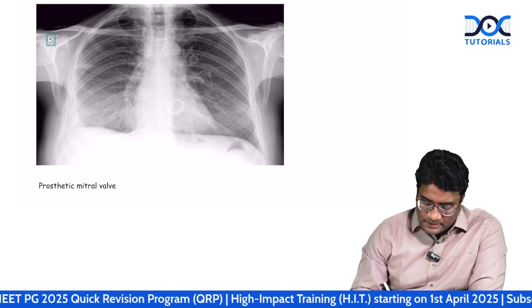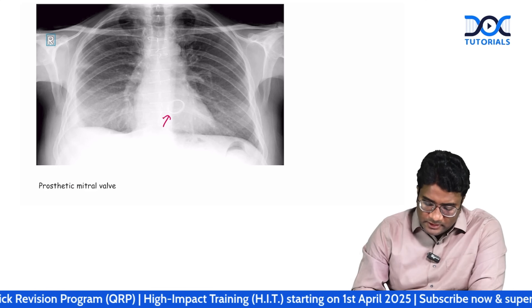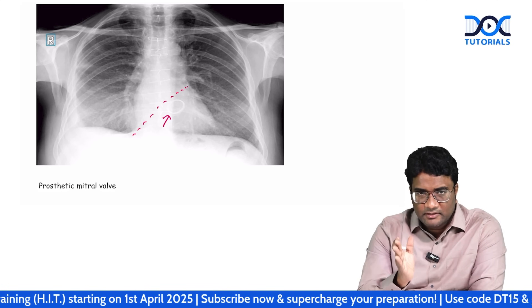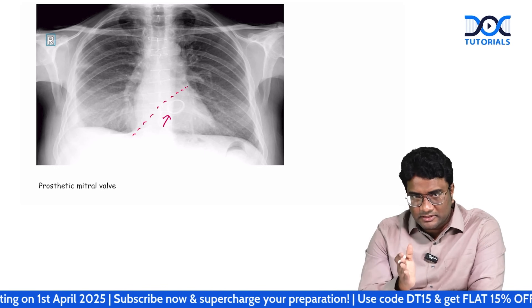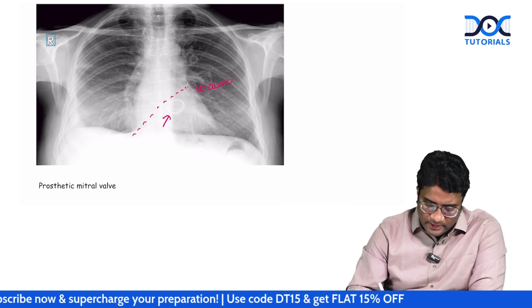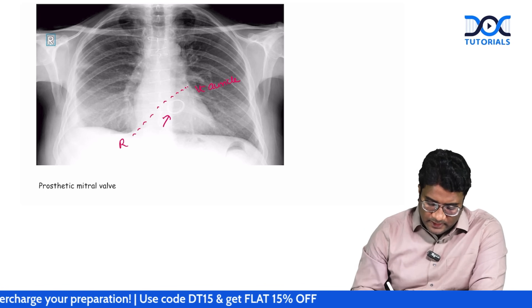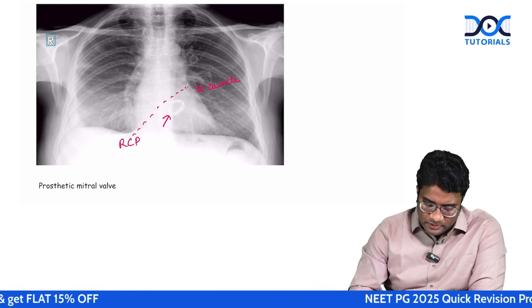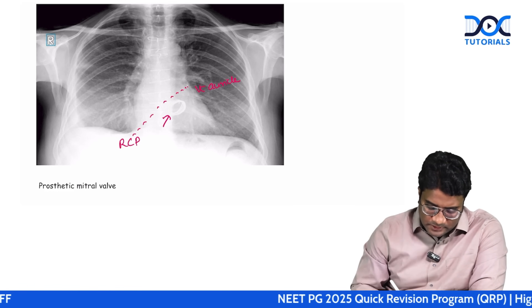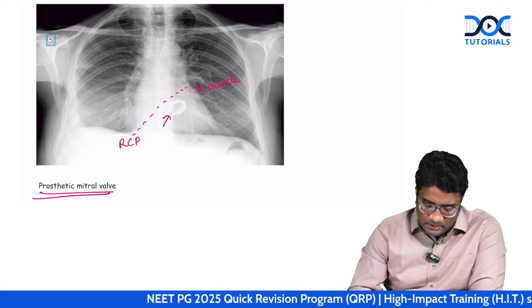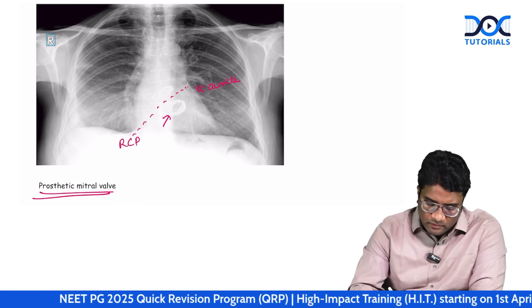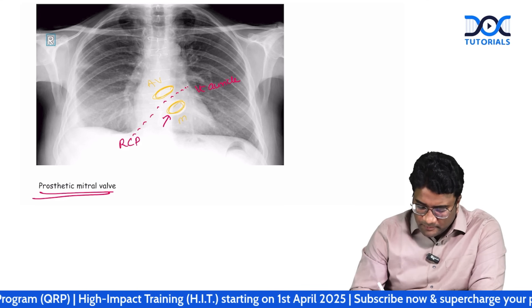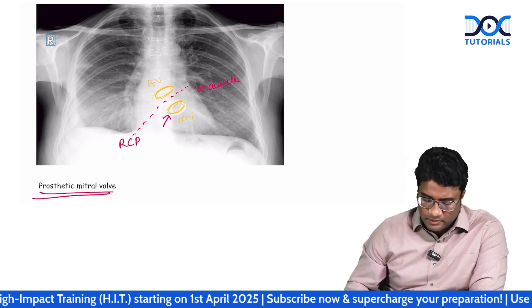Here you can see a prosthetic heart valve located below the imaginary line drawn from the left auricle, just below the left hilum, to the right cardiophrenic angle. If the valve is above this imaginary line, it is an aortic valve; if below, it is a mitral valve. That is how you identify prosthetic heart valves on radiograph.